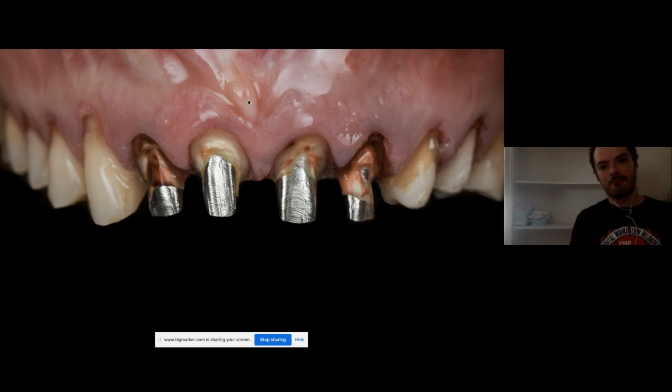Okay, if you want to be very precise in that, you have to put rubber dam when you do the build-ups. Then by the time you take the rubber dam off with the clamps and everything, it's going to be a complete mess. Rubber dam, you're never really confident that everything's okay. There's a second thing. Third thing is you just over prep and then you do copings, right?